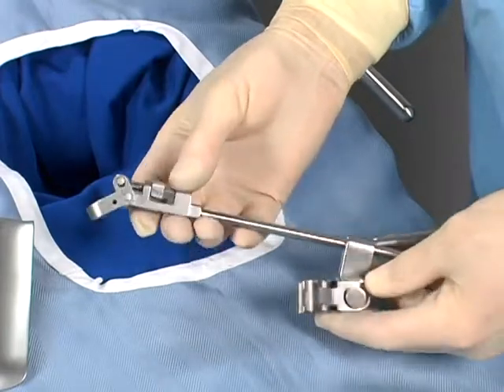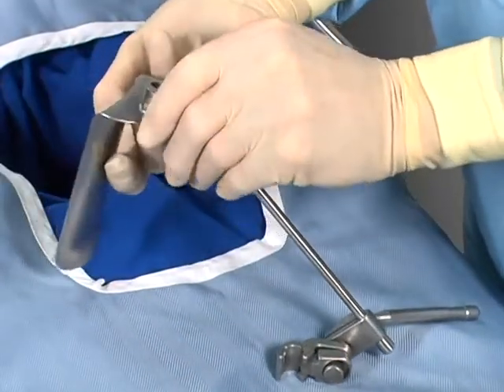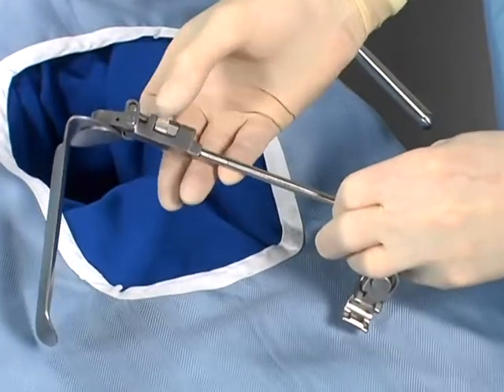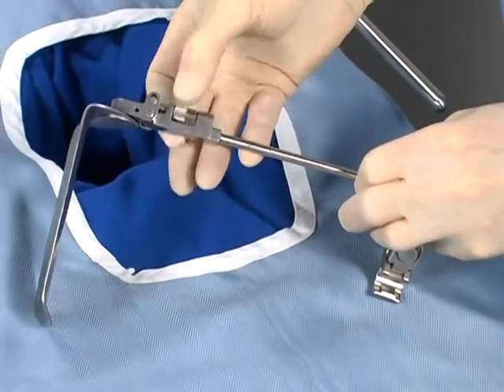Angling handles are available, allowing precise blade positioning for maximum exposure. The angling handle allows adjustment of the blade angle without adjustment to the frame arms. Without any pressure on the blade, rotate the thumb screw to adjust the blade to the desired position.